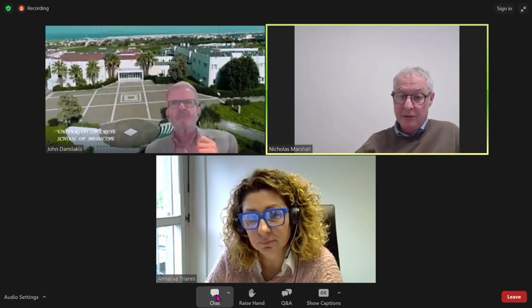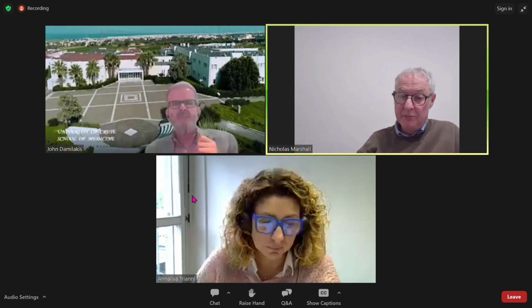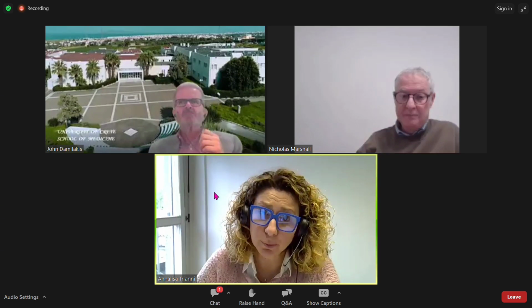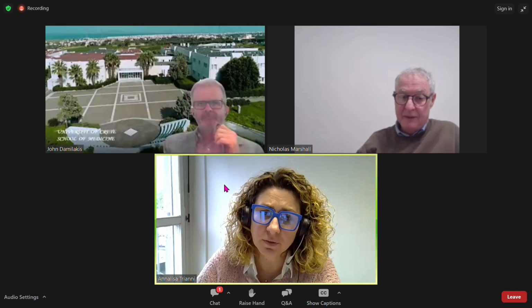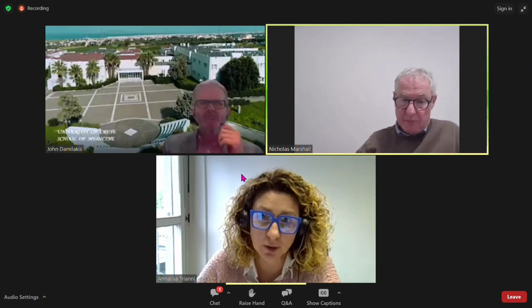But I would agree with the comment. I think if you do a very good acceptance or commissioning test, then I don't see why it should change. But there could be changes to the AEC programming over time. Yeah, there could be, especially if there's an update in the software version of the equipment.